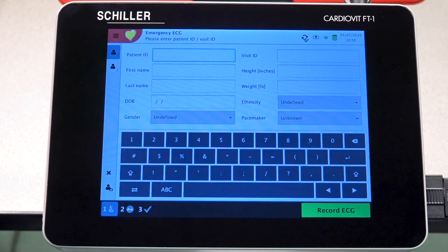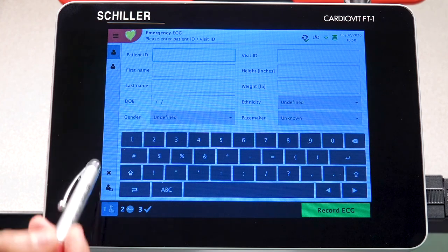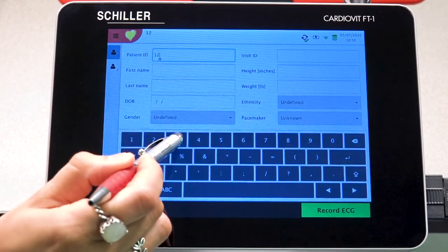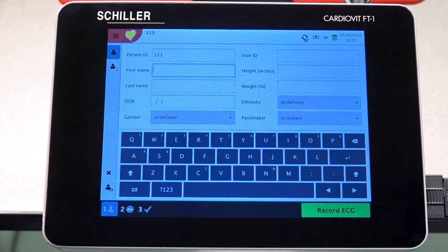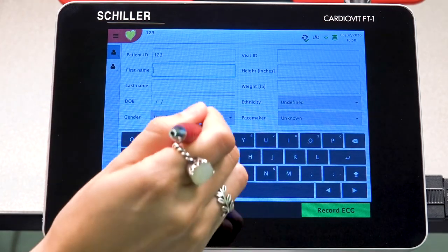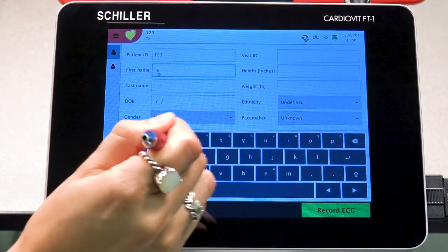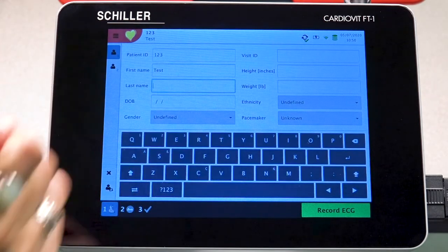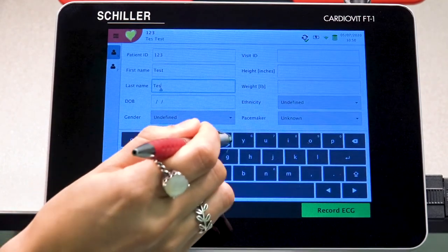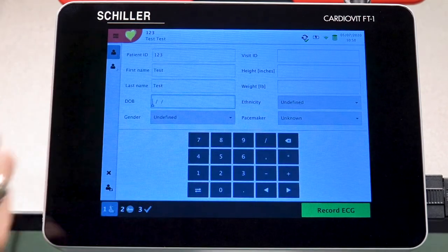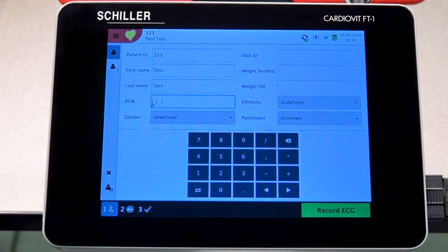We're going to go ahead and create a patient ID, and then move forward by entering the patient's first name, their last name, and the date of birth.